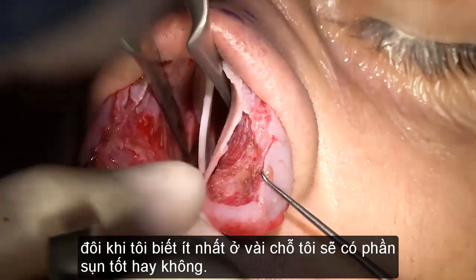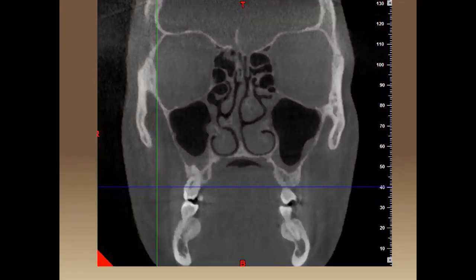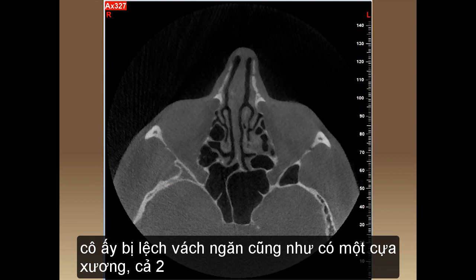So you see the spur on the right side, and the other view, the coronal.